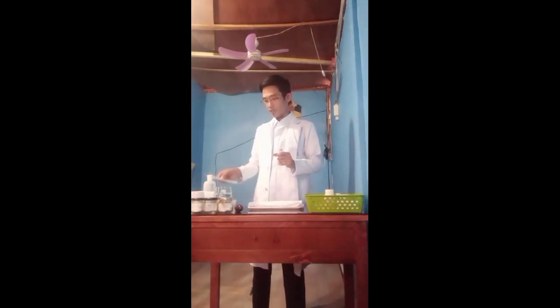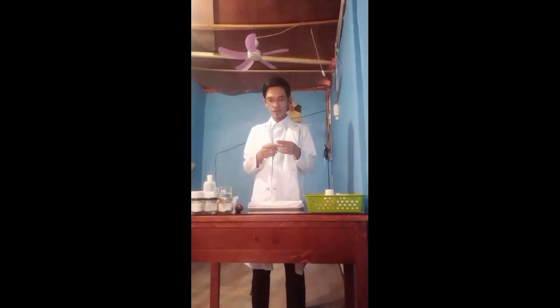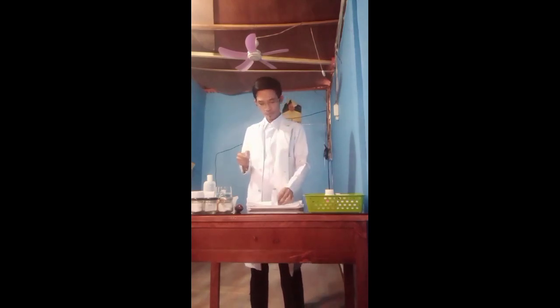So the waste is put in the waste receptacles. Before you get some of the sterile water for injection, you need to first remove the needle and change it into a gauge 23 needle. It's because the gauge 23 needle is longer than the needle for the tuberculin syringe.